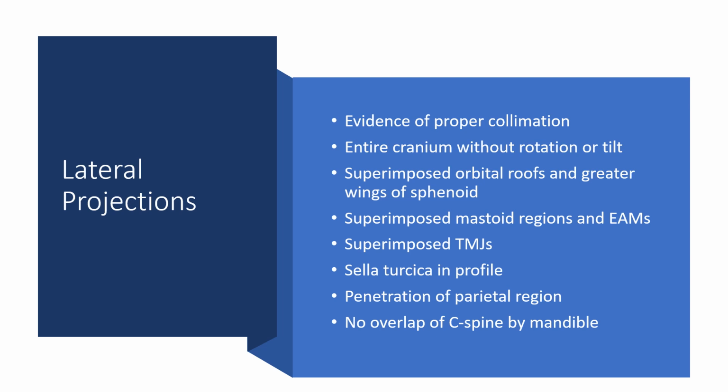Now what's the, oh wait a second, I want to say it's the infraorbital line is also horizontal. It may be the orbital line, orbital-meatal line, not the infraorbital line. Let me check the book. Hang on. Let me just stop and check the book because that's the best way to eliminate confusion.